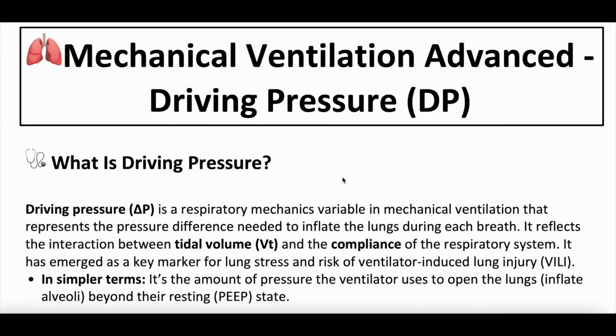Today's topic is one that a lot of people have kind of requested or brought up questions on. It's a Mechanical Ventilation Advanced series, specifically talking about driving pressure.